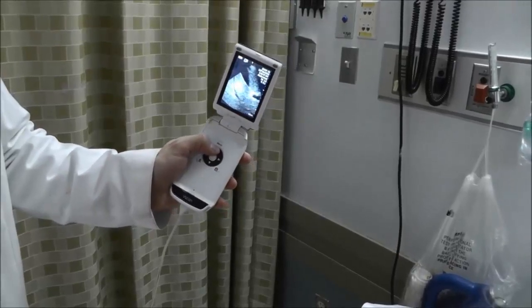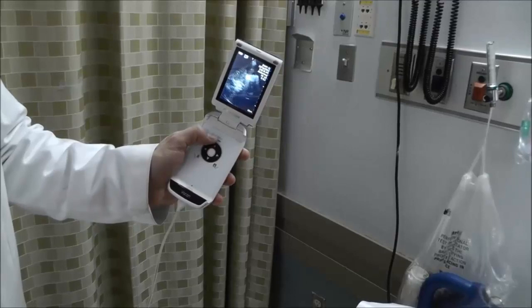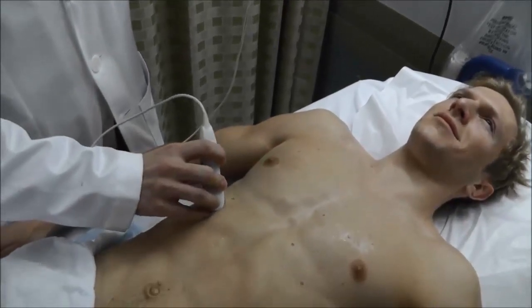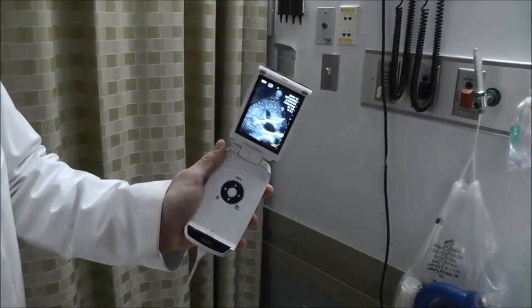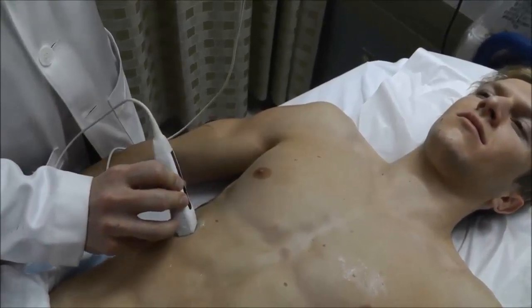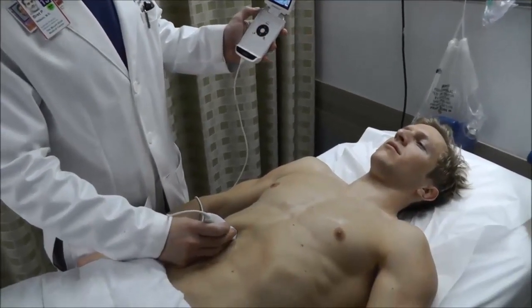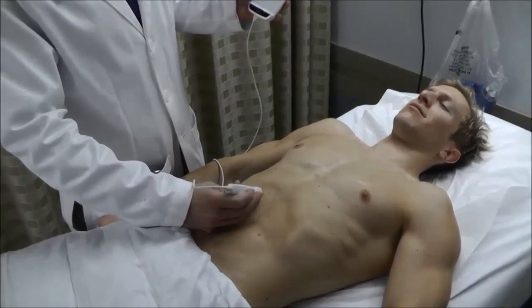If you have trouble visualizing the gallbladder, you can ask the patient to take a deep breath and hold it, which lowers the gallbladder further into the abdomen. Another approach is to look above the ribs — sliding in between the ribs should allow you to still see the gallbladder, and there it is in the center of the screen. Fan up and down to get a view of the gallbladder. When you ask the patient if the point where you're visualizing the gallbladder is the most tender spot on their abdomen, that's a sonographic Murphy sign. If the patient says yes, that's a positive sonographic Murphy sign.